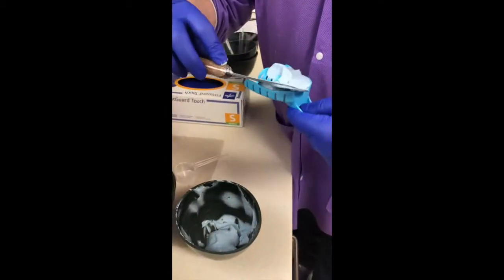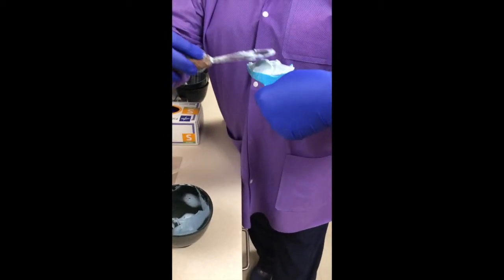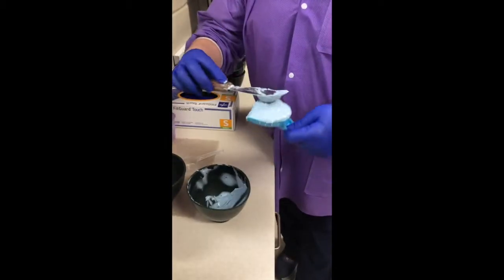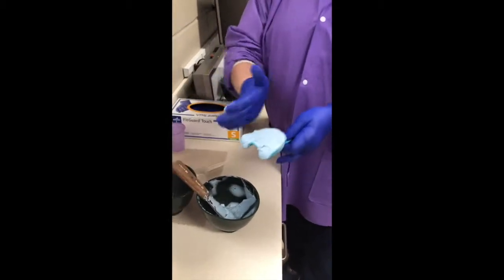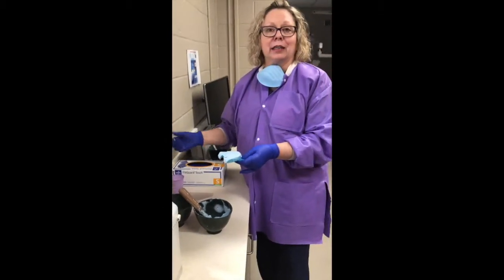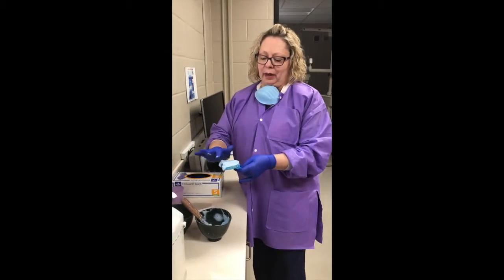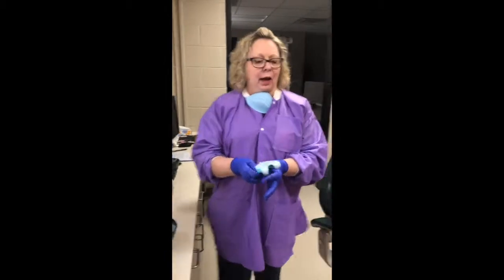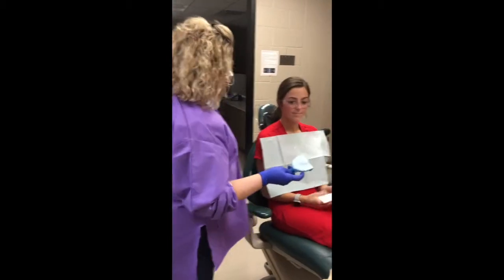So if you use the side of your tray kind of as a way to scrape some of that excess off. And where she has teeth, it's going to displace a lot of this material that's inside there, so there's no need to pile it up super high to overfill it, because that extra has to go somewhere, which generally might be down their throat, so we don't want that to happen. I'm dipping my fingers in a little bit of water here to just smooth it across the edge, right? I'm going to hand our patient here some extra gauze, just in case I get this all over her.